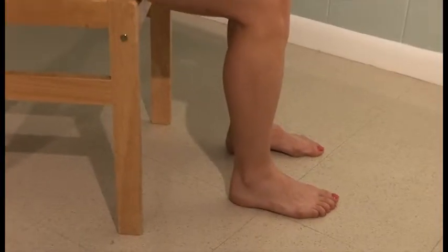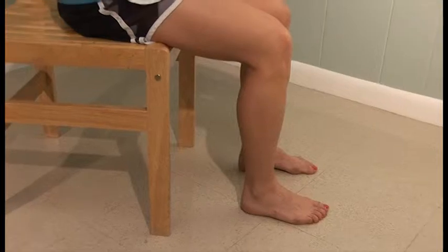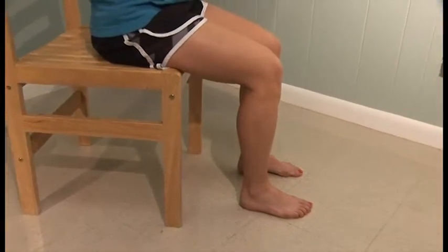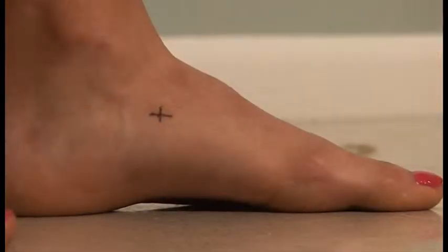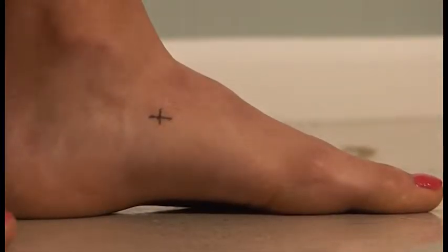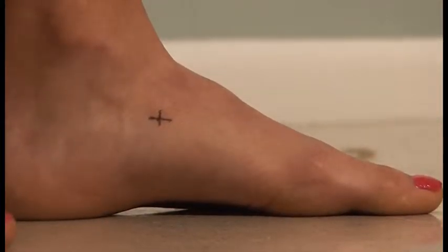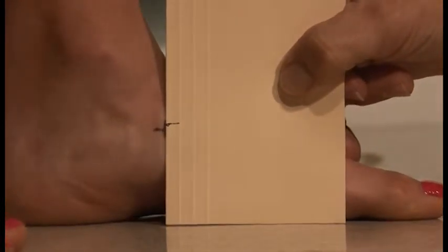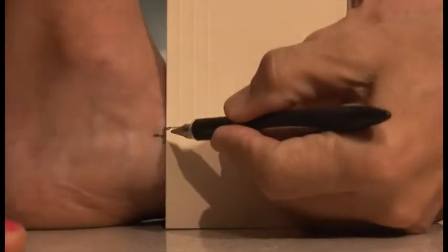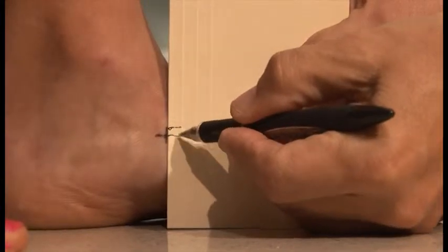We use the navicular drop test, and for this test we begin by placing our patient in a chair with their knee directly over the ankle. As you can see, we've placed a mark on the navicular tuberosity. We place a piece of cardboard on the floor adjacent to the mark and extend the mark onto the card. The patient then stands. In a supinatory foot, there is very little movement of the mark, typically less than 6 to 8 millimeters.